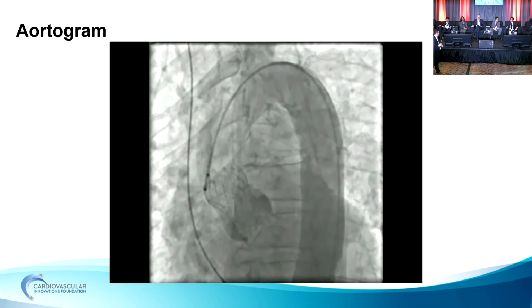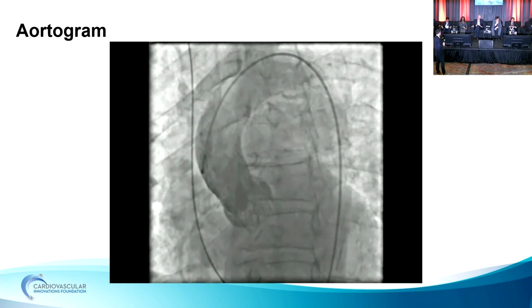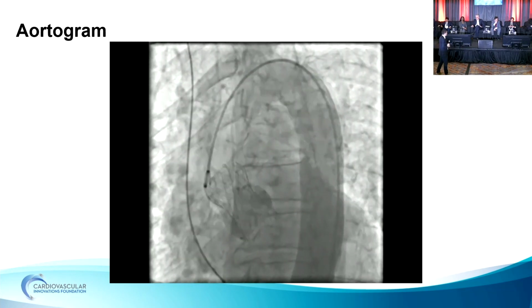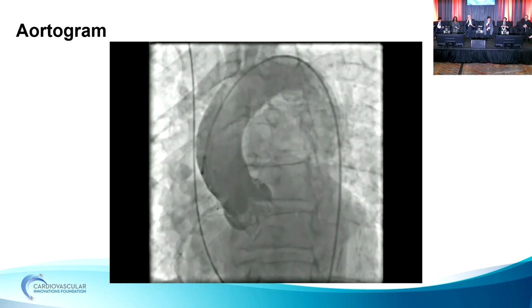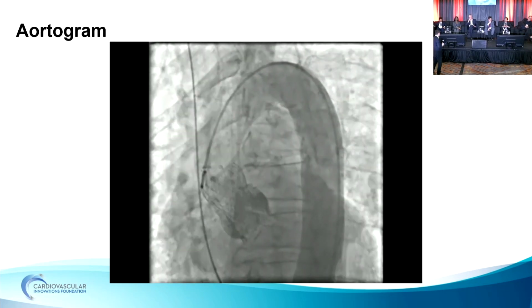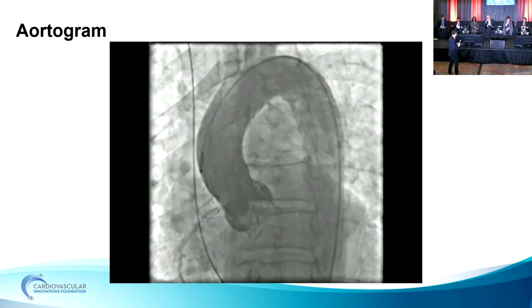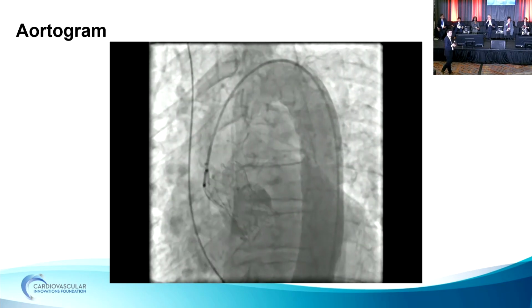What do you think is happening? I guess our first question right now is, yes, we know that the ostium is closed and we're planning on opening it, but how did that ostium close? Our coronary heights are good, so we're not worried that the native leaflet closed. We had at least 14 millimeters. Our valve depth is pretty good. There is enough space in the sinuses, so you can see the sinuses are filling. So our thought at this point is we embolized with something. And the question is, what did we embolize with, and how can we save it?